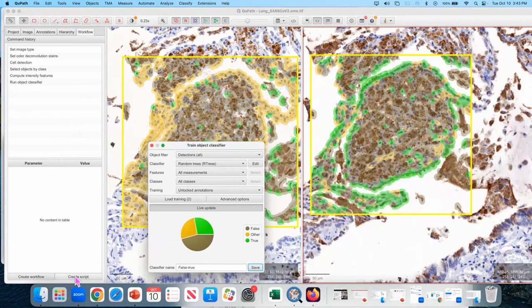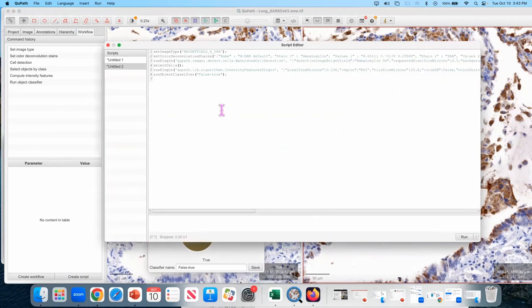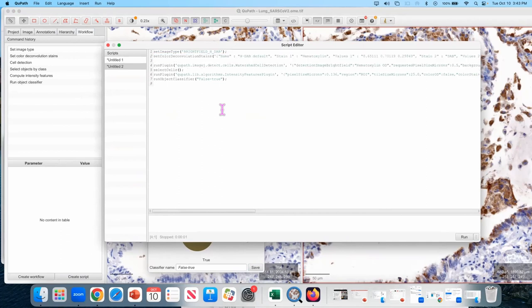I'm going to quickly create a script. And this is just going to be explained and repeated a little bit more later. So this script is setting the image type to brightfield H-DAB. Then it's executing a command to do color deconvolution. Then it's doing watershed cell detection. And it then asks the script to select the cells, run the plugin to create my intensity features, and then apply the classifier.